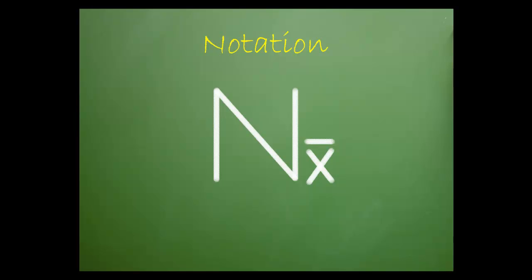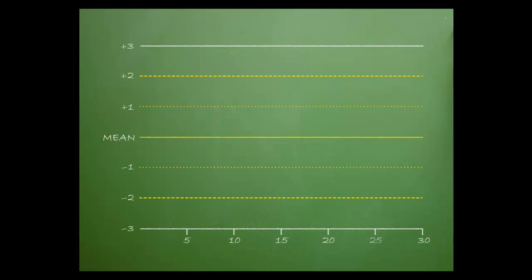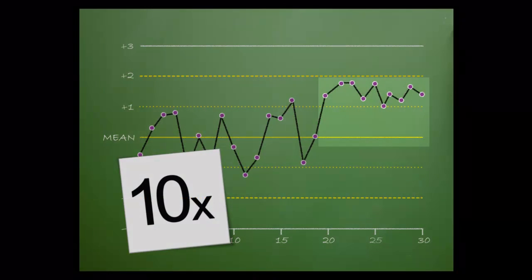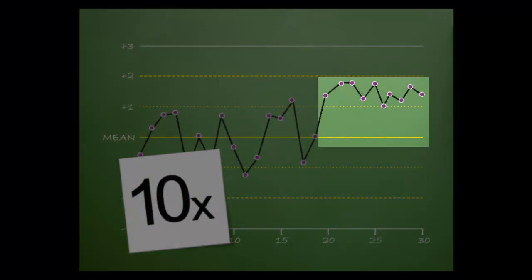Another type of rule notation follows this pattern: N equals the number of QC points and X-bar is the mean. Here we see the mean. In this case there are ten consecutive points on the same side of the mean.